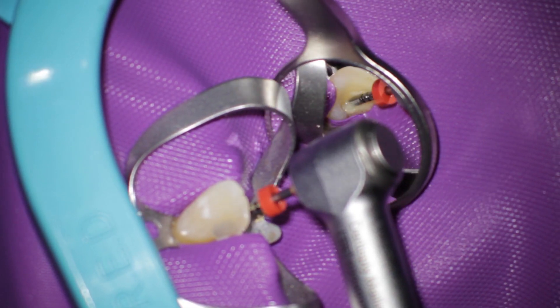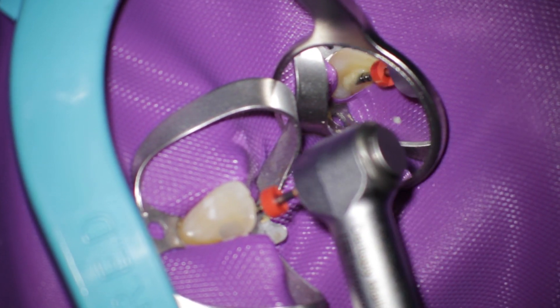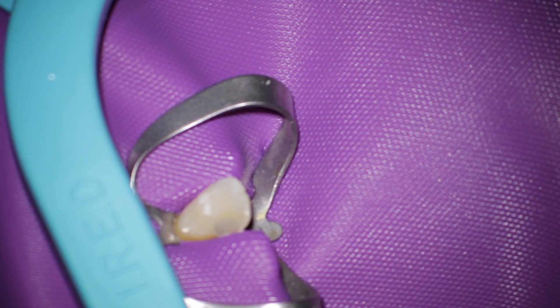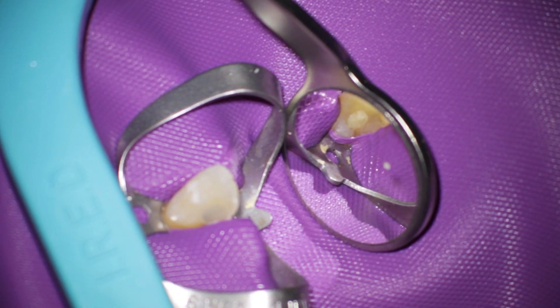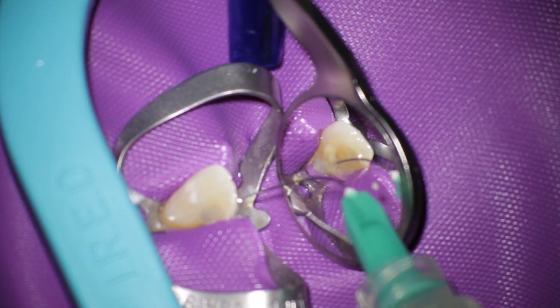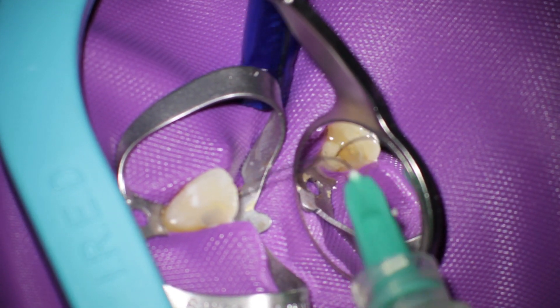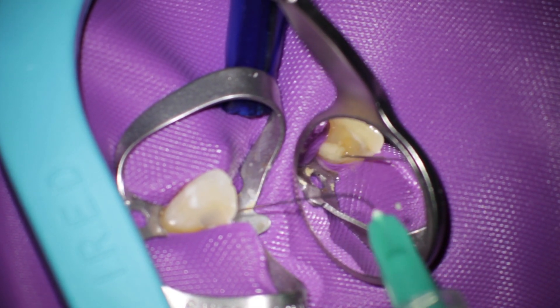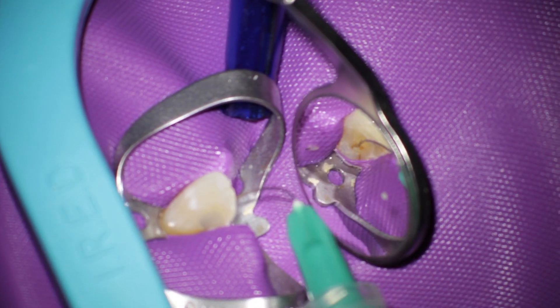I rinsed out the paste and then I went through the tooth to the apical length. You can see there was a lot of debris inside this tooth. I rinsed out this debris with irrigation solution — first I used CHX and then I used sodium hypochlorite.